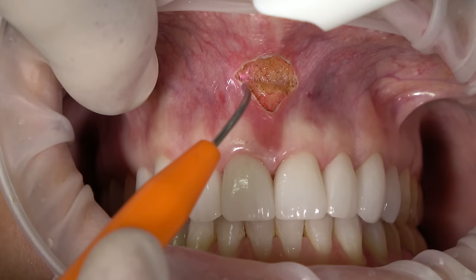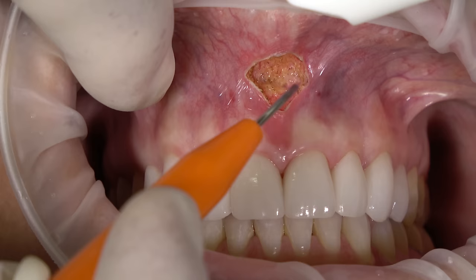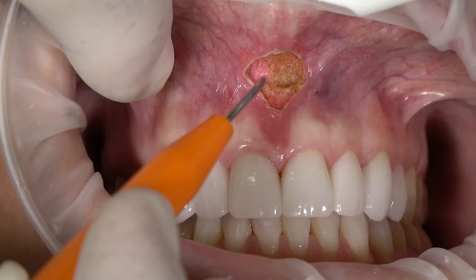It's just a very light touch. If I do get a little bit of bleeding, if I hit a small artery, again the diode laser is attracted to the hemoglobin, so I can just cauterize that bleeding point and move forward.